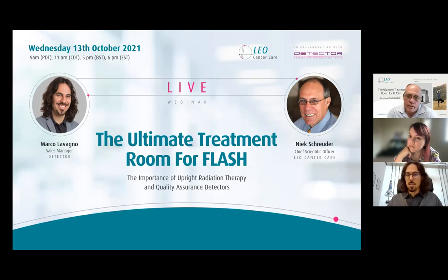Let me just jump in here, Marco. I would not think it would be linear with dose rate if there was a pulse process. So yeah, I do think you're capturing it. I think part of the question is whether you can derive the timing information from your electronics, to say I'm seeing pulses, that is the timing structure of the pulses coming back from the detector. Right?